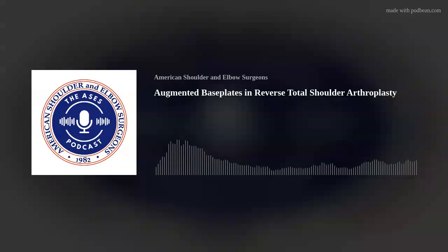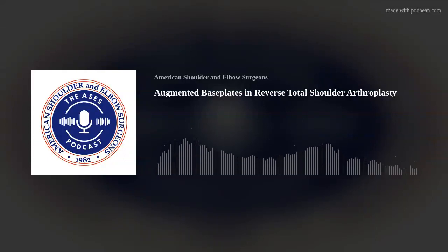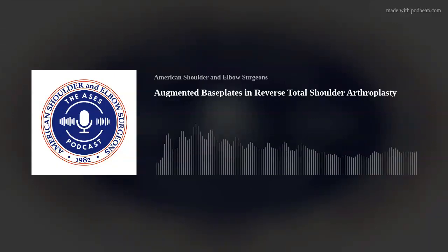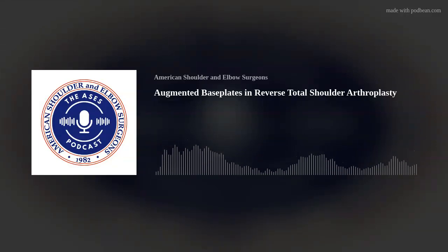And then what about you, Andy? As you approach that revision patient, the patient we all sweat about, what is your rubric? What is your paradigm or your usual guidelines you use? Yeah, so I think at this point I feel contained defects. Most of the time I can do that in one stage.